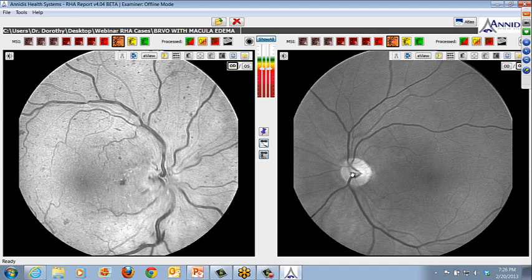But in the left eye here, you can see he has a very tiny disc. There is no discernible cup. And the artery and the vein are in very intimate relationship with one another, a very confined space, if you will, against the lamina cribrosa. He was also ocular hypertensive, so his eye pressure was bouncing between 25 and 30 for the first couple of visits that I saw him before this happened, and I placed him on IOP lowering medication, of course.